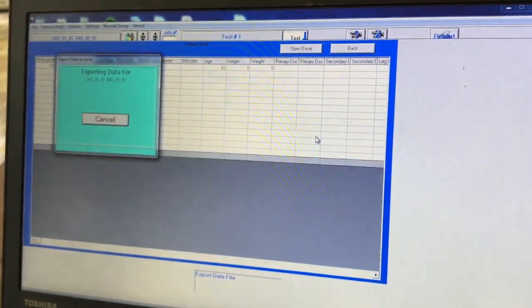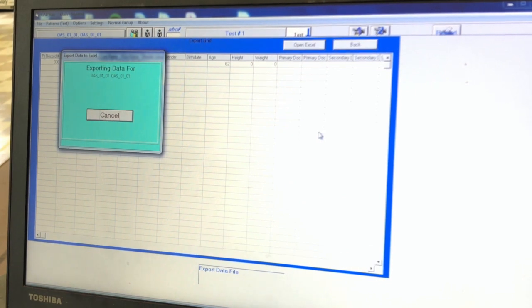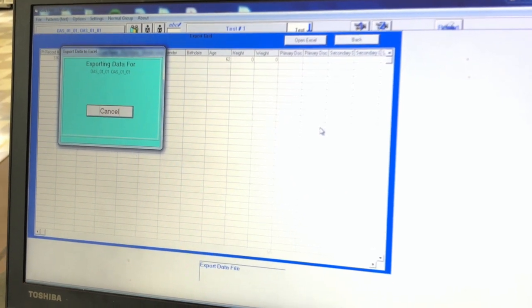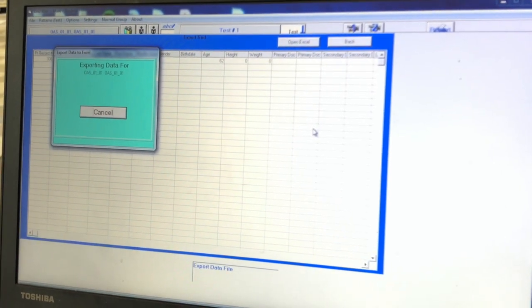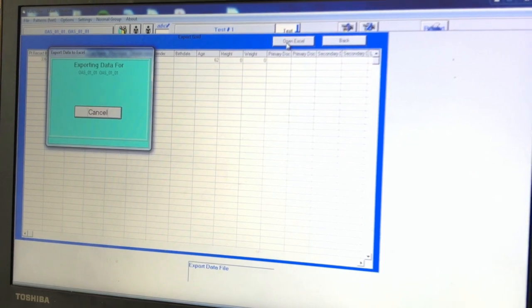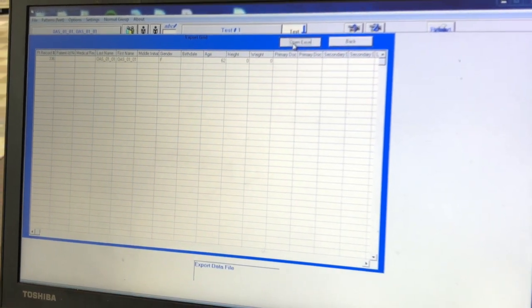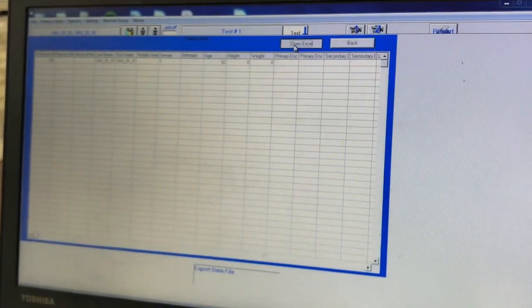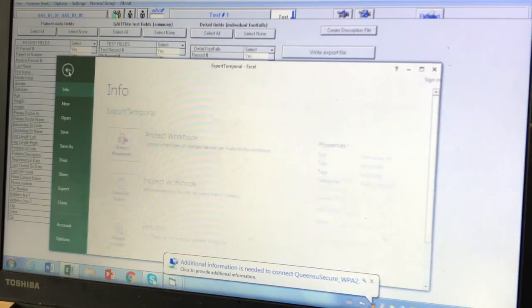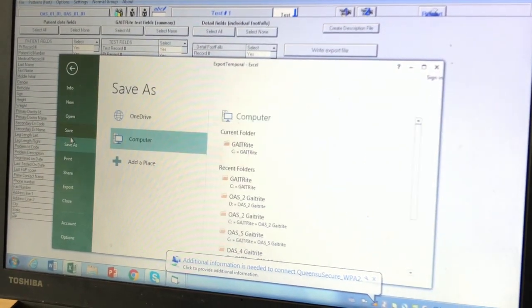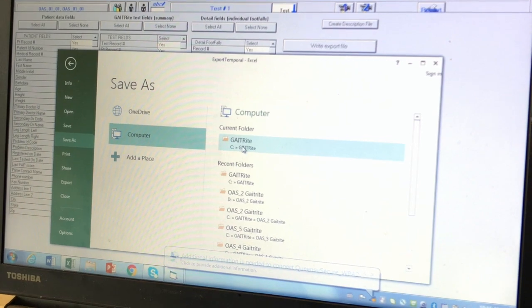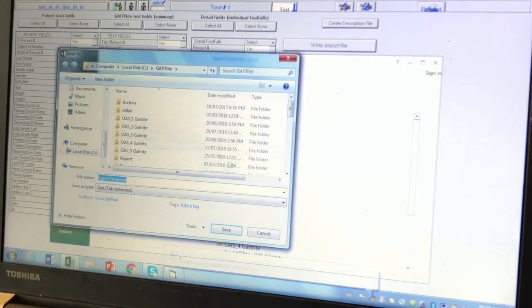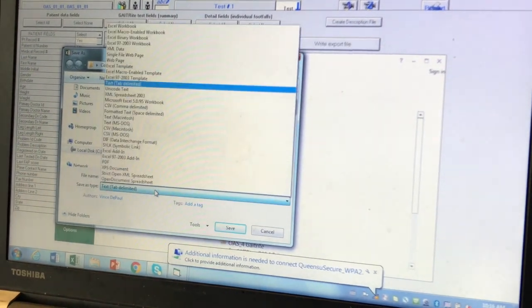This will bring you to another page where it will say exporting Excel data. Once it finishes loading, click on the open Excel box located on the top right just under test. This will open the data in Excel where you will want to go to file and then save the data as an Excel workbook dot xlsx and save it under the participants assigned code.